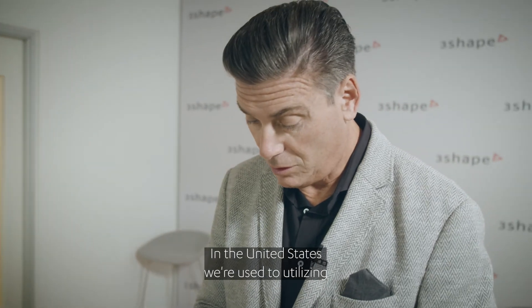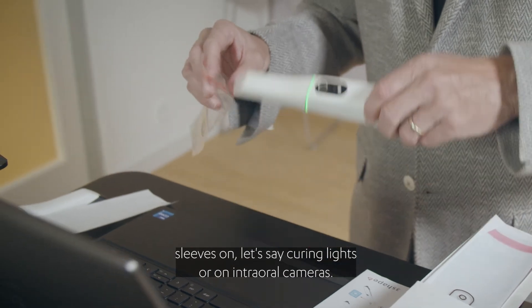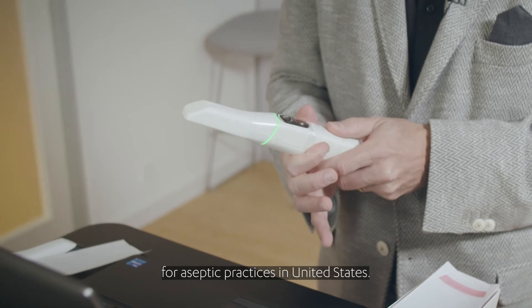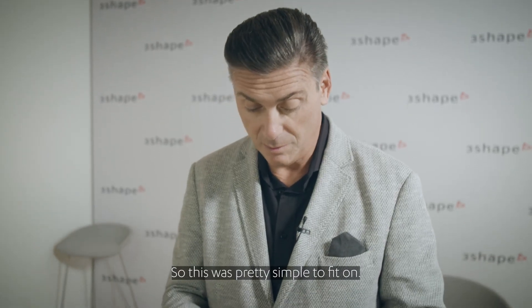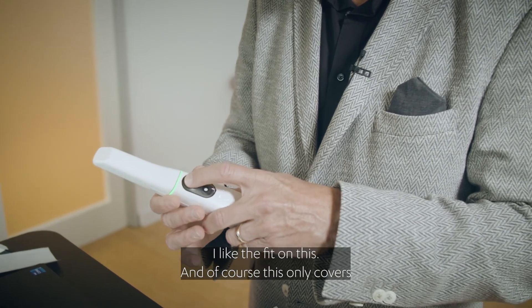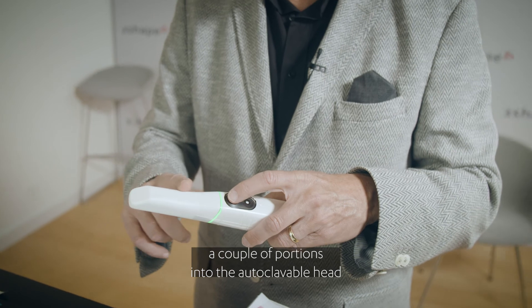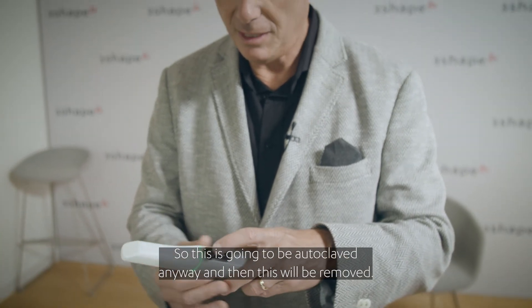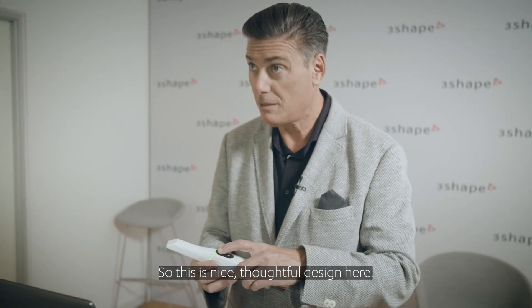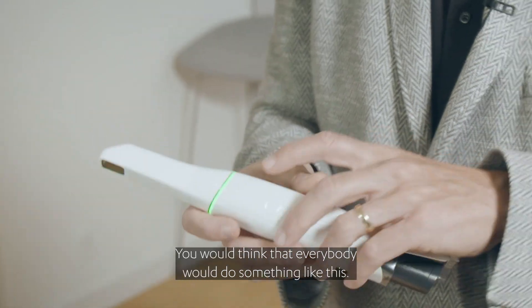In the United States we're used to utilizing sleeves on curing lights or intraoral cameras for aseptic practices. This was pretty simple — the fit is really quite good. I like the fit, and of course this only covers a couple portions since the head is autoclavable anyway, and then the sleeve is removed. It's a nice, thoughtful design — intuitive. You would think that everybody would do something like this.